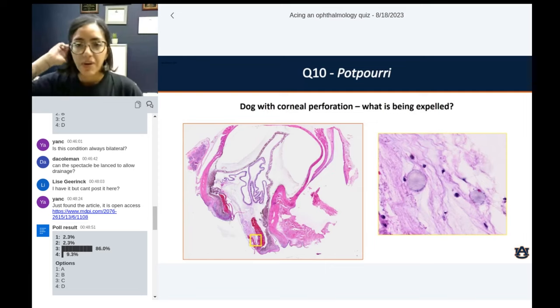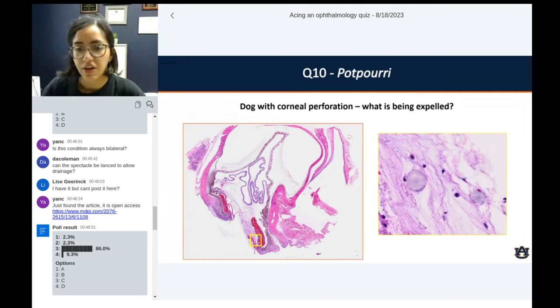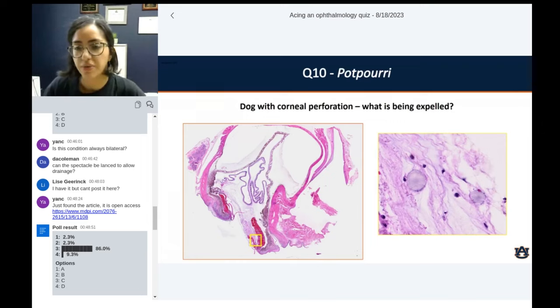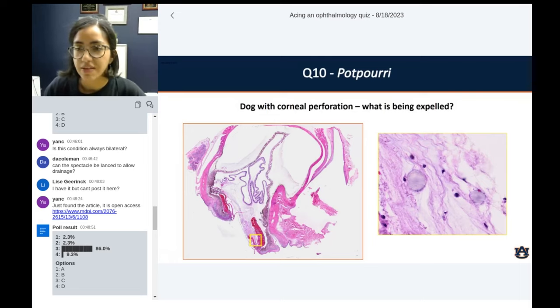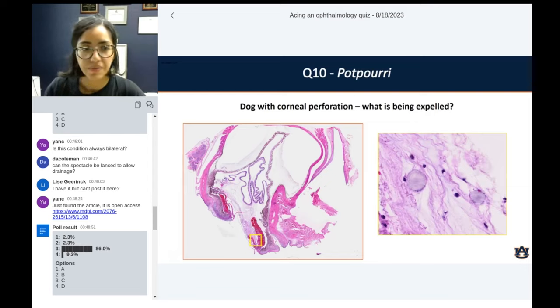This dog came with a perforation. This is from our routine — this dog had a really bad keratomalacia to begin with, which led to perforation. But on the very rostral part of this eye, I saw these. So what is actually being expelled at this point here?